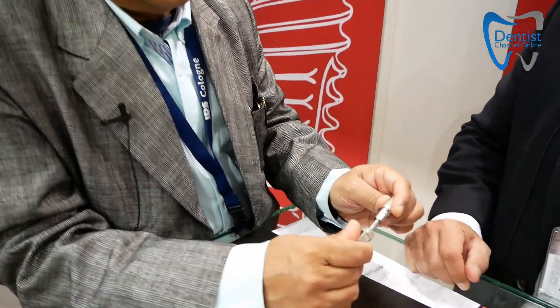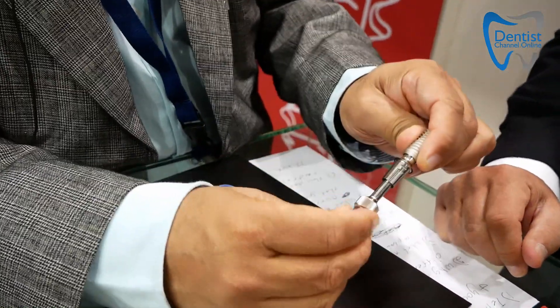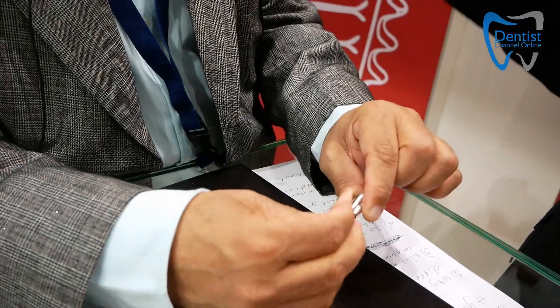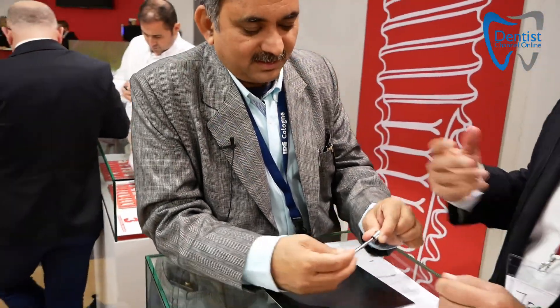Argon is the only company that has an internally connected true Morse taper implant. So again, now you have the benefit of aesthetics with your custom milled abutments, anterior aesthetics, etc. In the posterior, obviously, you can do the same thing, but it's not as critical as it is in the anterior.